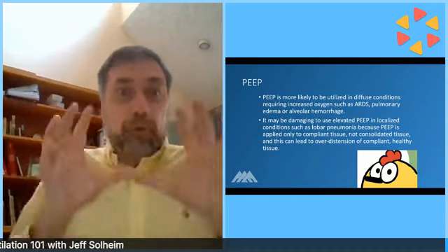But it can be very damaging to use elevated PEEP if there's a localized condition like a pneumonia, because the pneumonia is not going to accept oxygen, which means that extra pressure you're putting in is going to go to the healthier part of the lung where there's no pneumonia and overdistend it. So you've got to be really careful with PEEP if your patient has a known local problem. PEEP is best for diffuse problems like ARDS or pulmonary edema.